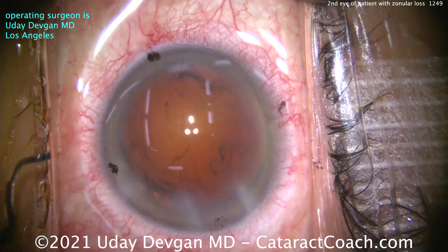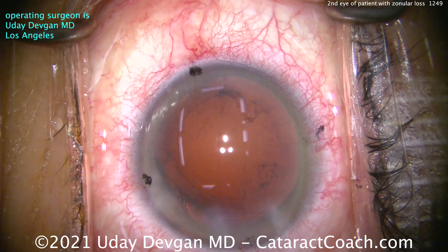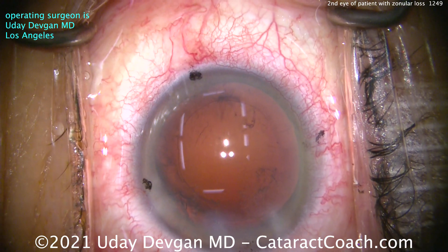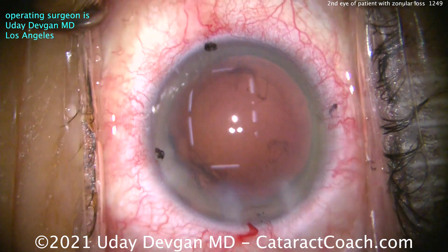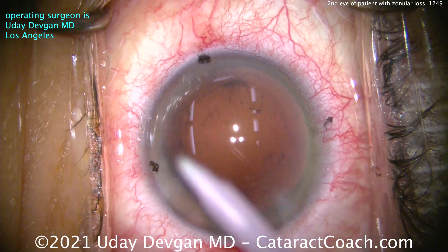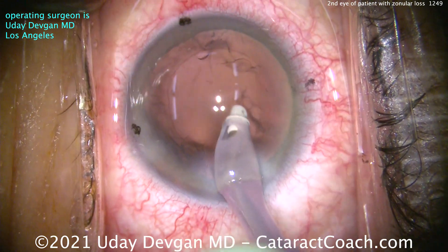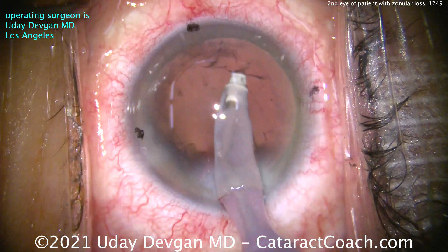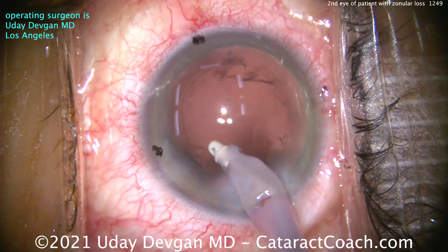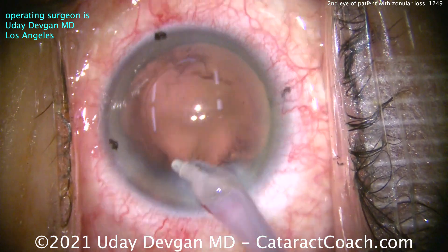Remember: give the first surgeon the benefit of the doubt — patient protoplasm, patient tissue — that's what makes this game so challenging and so fun. You never know what you're going to get into. In this case, everything's normal. You can tell this video is at real time, not sped up. The whole case is about 6 minutes, so it's not difficult. But the point is: you've got to do things a little differently on the second eye if your first eye had issues.